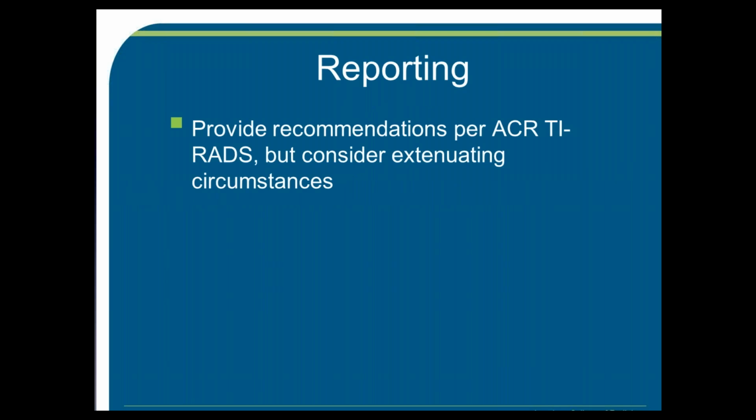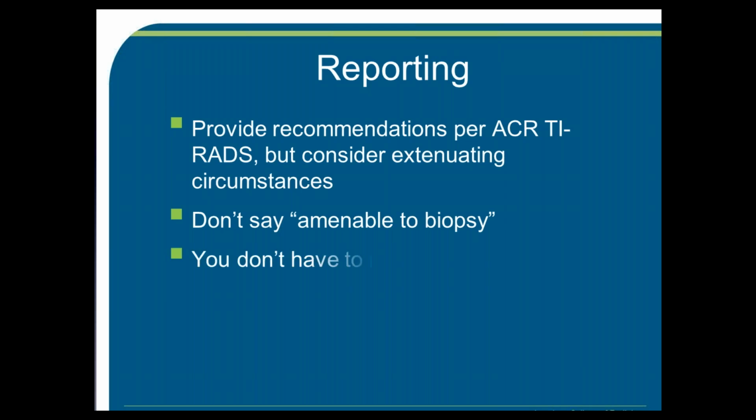On reporting, I give recommendations per ACR TI-RADS, but as I mentioned earlier, it's important to consider extenuating circumstances, including comorbidities and other factors such as family history or exposure to radiation. It's important never to say just that a nodule is amenable to biopsy, because every nodule is technically amenable to biopsy, at least almost all of them are, and it's incumbent on us to give recommendations. And finally, this is a question I receive often, you don't have to report the suspicion level. In fact, I never do, because patients see our reports and they will understandably wonder why a TR5 nodule is not being biopsied or followed.